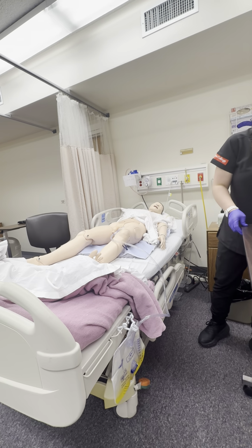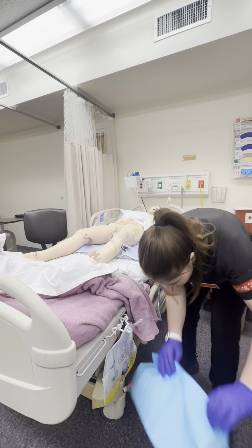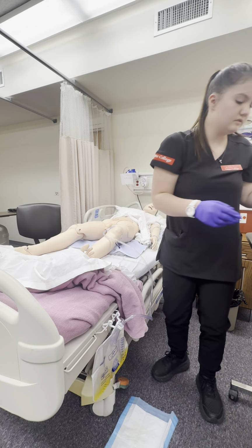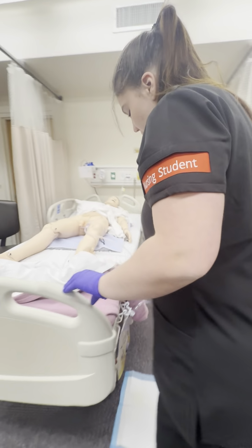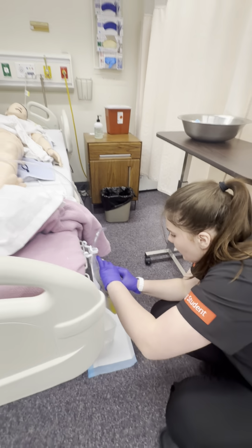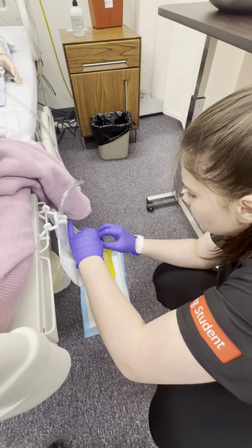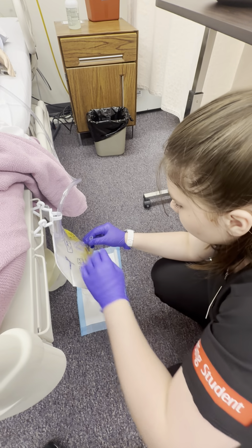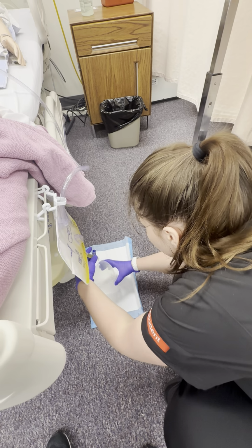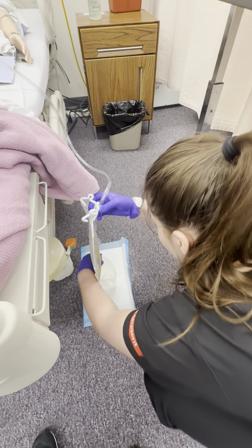So I'm gonna go ahead and take my disposable chucks and just lay that on the floor. And we're gonna go ahead and note the output. I'm also gonna look at the characteristics of the urine itself. I'm not seeing any cloudiness, any blood, or any external signs of infection that I should be worried about. Okay, this is still clamped, and I'm going to go ahead, we can unclip it from here.